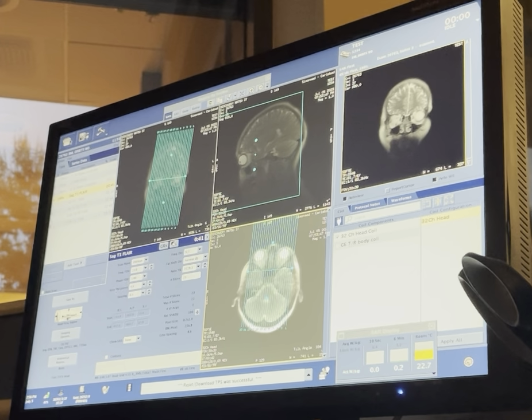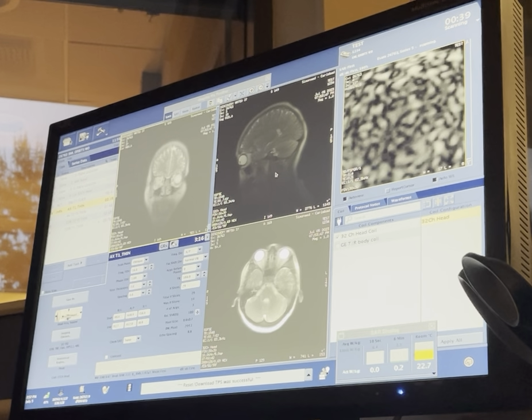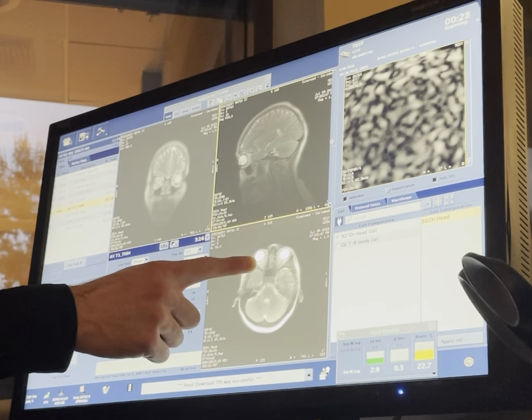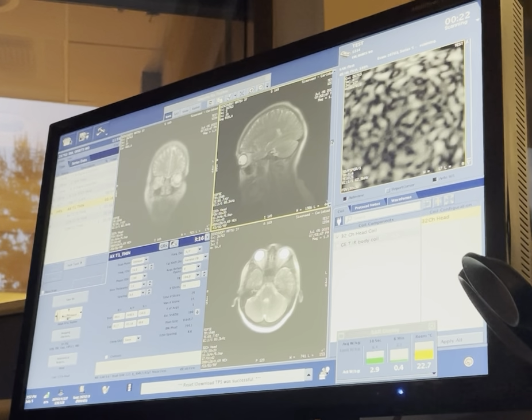Okay, so now let's go on our axial. And now I'm gonna have you open up your, yeah. And now let's go to your coronal and let's brighten it up. So I want you to go left more. And up, yeah, something like that, cool. And now let's do the same over there, even though in 30 seconds we'll get a new one. There you go, okay. So let's scroll through there and see if we can find the optic nerve. So we know that the optic nerve goes that way, right? And it should go right behind the middle of the eyeball. So let's look for it. We can see a little bit of it right there. Just a little bit. Keep going.